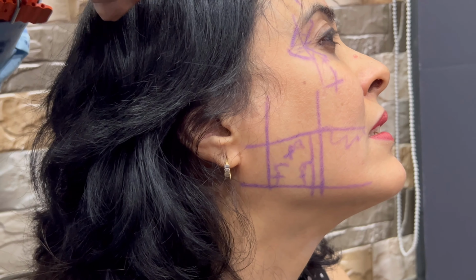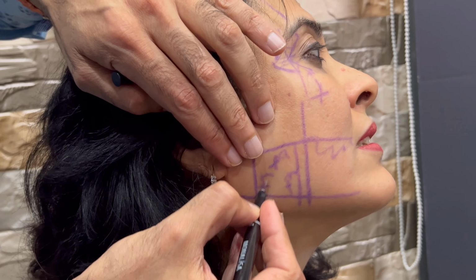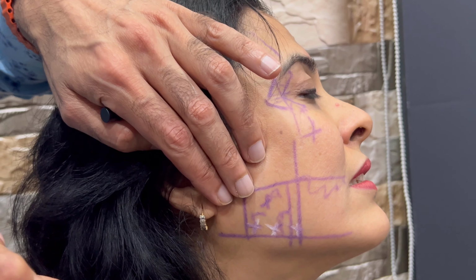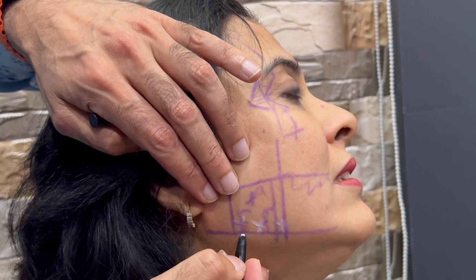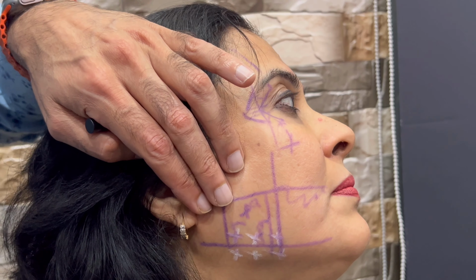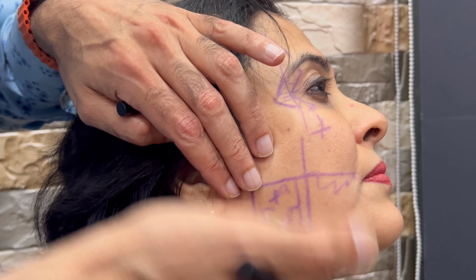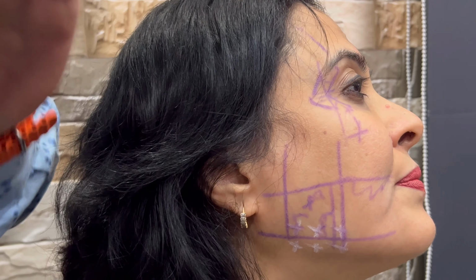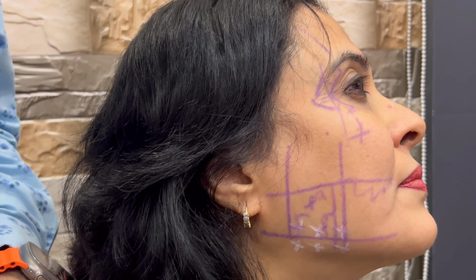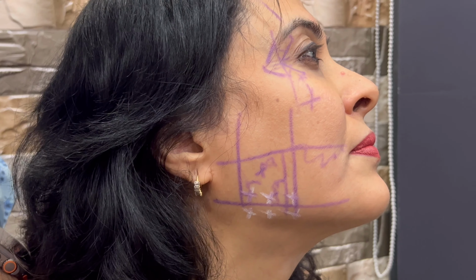I'm going to change colors so there's not as much confusion. I'm going to do 1, 2, 3 above the line, 1, 2, 3 below the line. Same as the masseter, but this is platysma. Masseter is a deep muscle. This injection is supraperiosteal, intramuscular. This injection is subdermal. So it's a different depth.